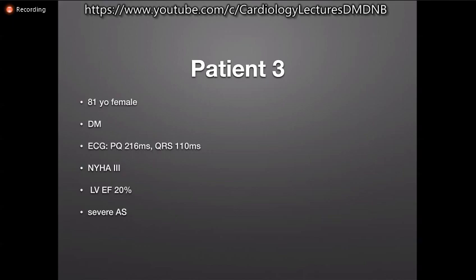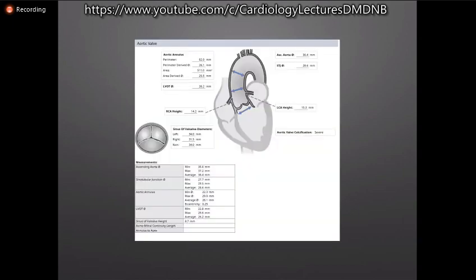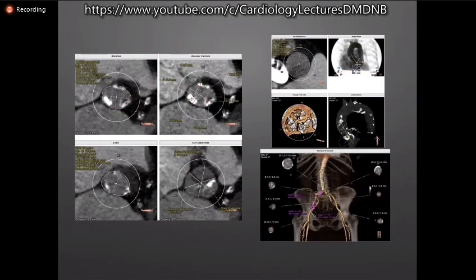The third one. I was a little bit skeptical about this one at the beginning, but our team decided to proceed, and you will see why. So this was an 81 year old female with diabetes, with borderline changes on the ECG, and with a bad LV function, severe aortic stenosis. We did the measurements. Also, it was quite normal. But then if you look at the images here, you will see that there are chunks of calcium at the annulus level, which are at a very high risk of annular rupture.